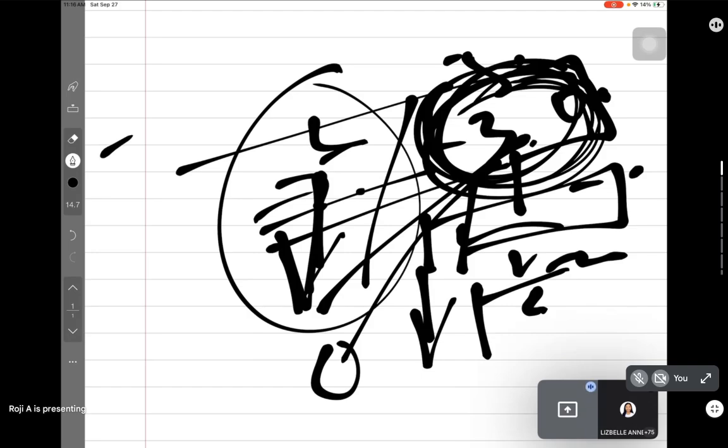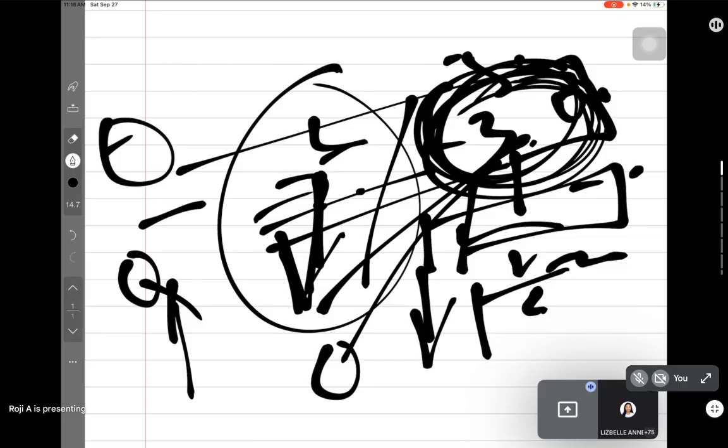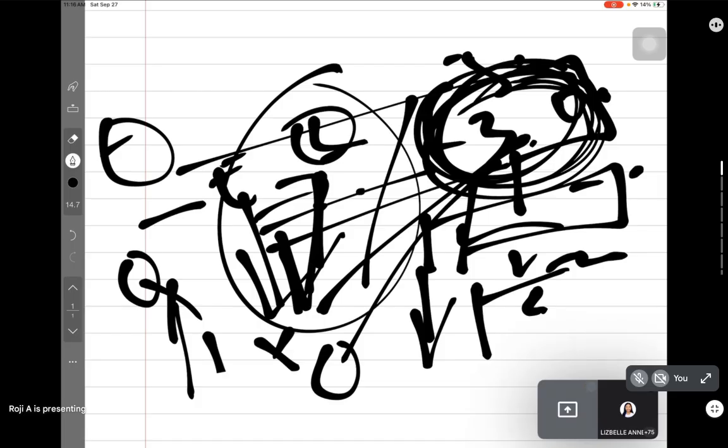If giving plus, I need to go maximum. But understanding the behavior of your binocular vision, if this creates more ESO, I will reduce my minus. If this creates EXO, I will reduce my plus. Do you understand binocular vision? Lizelle, is it clear so far?